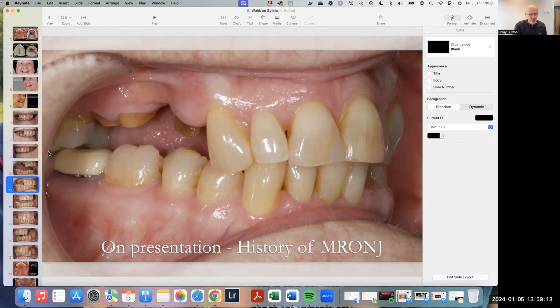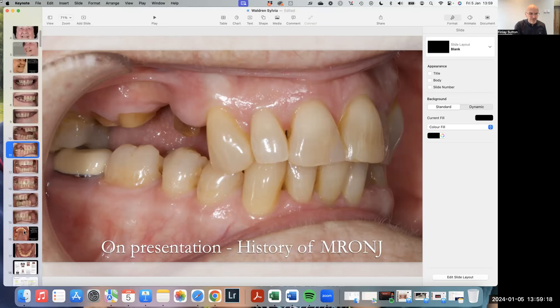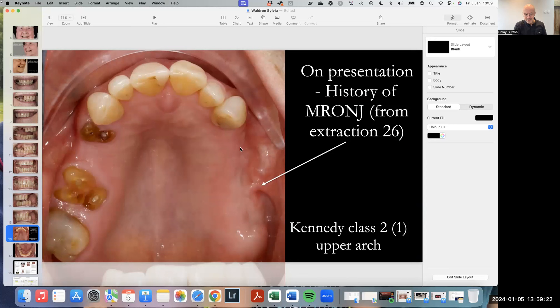This lady had MRONJ, which is really interesting. It is increasingly a problem with these long-term bisphosphonate patients.